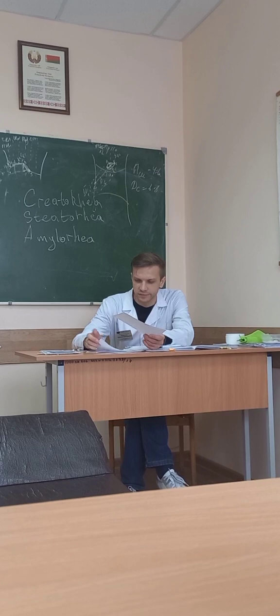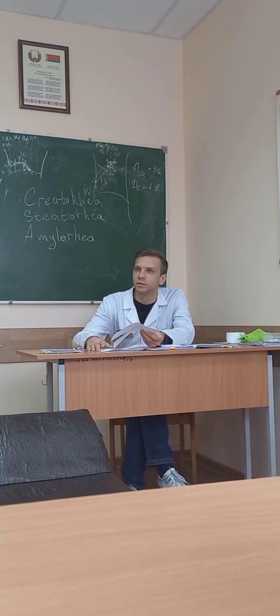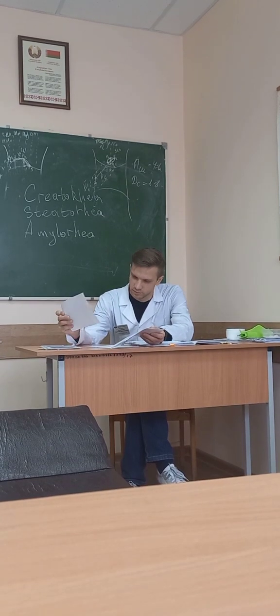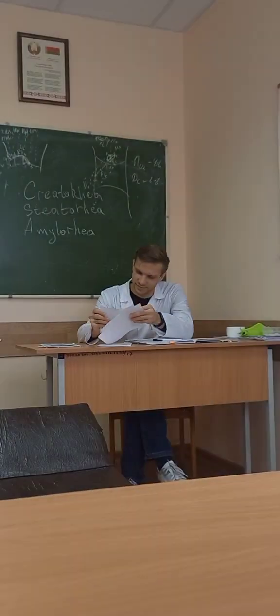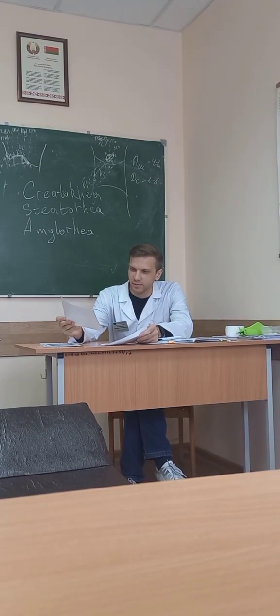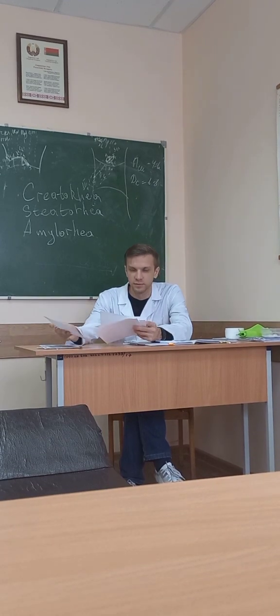Does somebody have stomach bleeding? Blood present. It's in my chart too. Melena, presence of hidden blood and red blood cells, erythrocytes, right? Yeah, I have.